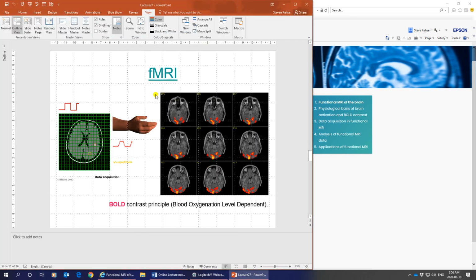Okay? So functional MRI, so here's this view graph, which you should now remember from that animation we just saw. Here's an actual MR image with the physiology, and then on top of that you superimpose these BOLD, blood oxygenation level areas that seem to be lighting up.